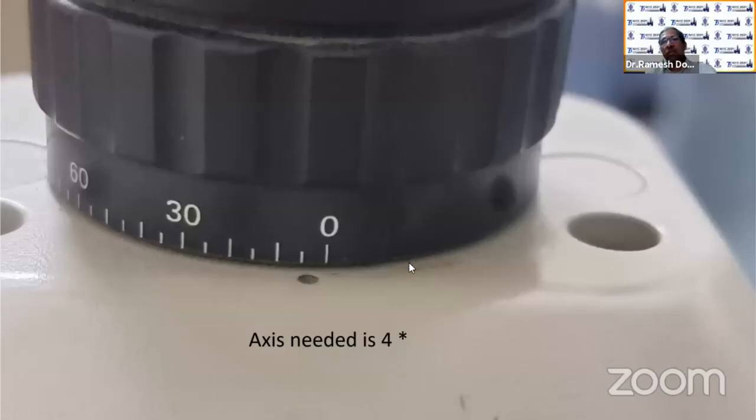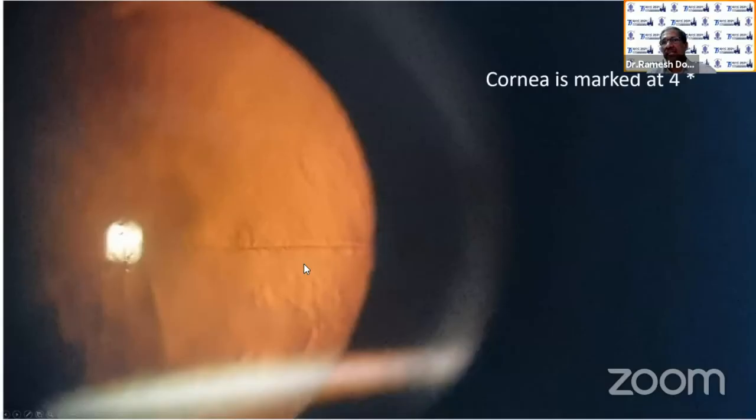So how do you do a manual marking? Use a very thin slit. Move the collimated dial on your slit lamp till you get the correct axis. For this patient, it needed 4 degrees. This is 0. This is 5. This is 10 degrees. So 4 degrees is slightly short of the 5-degree mark.